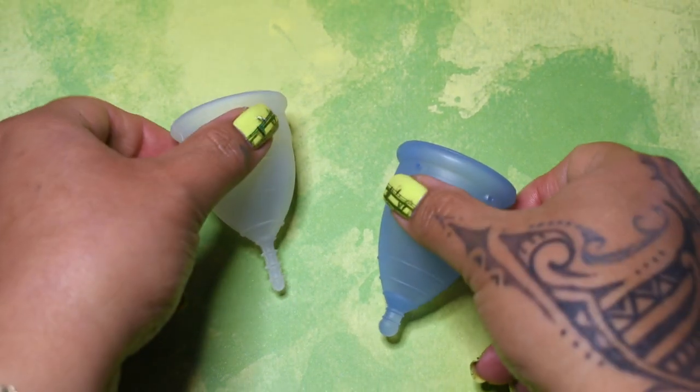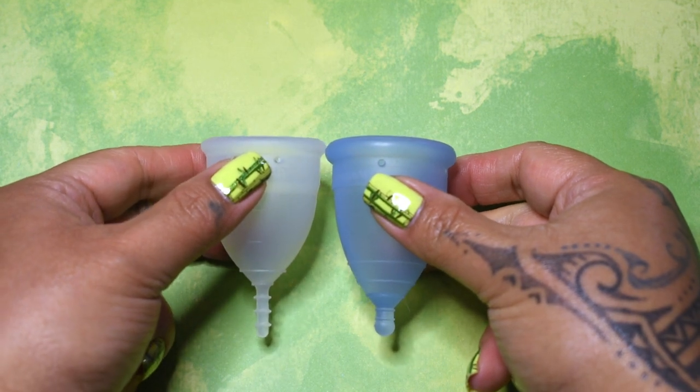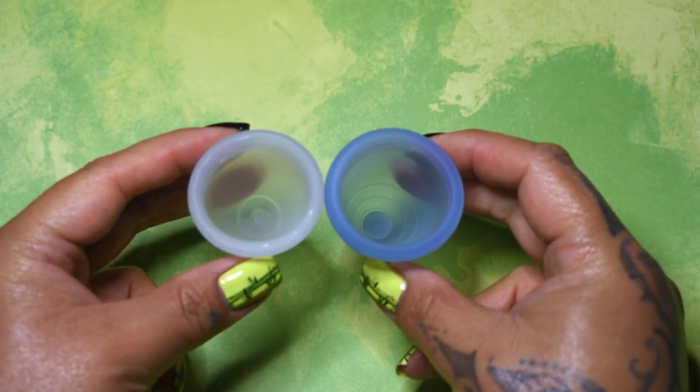I'm going to place both of these cups in the palms of my hands, give them a squish, swap hands, give them a squish again, and then compare the rims.